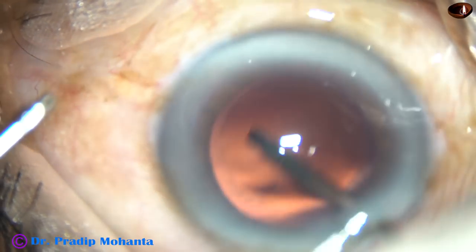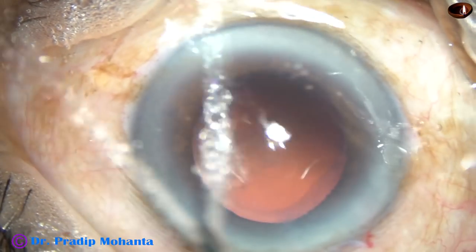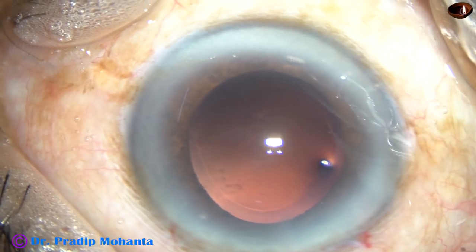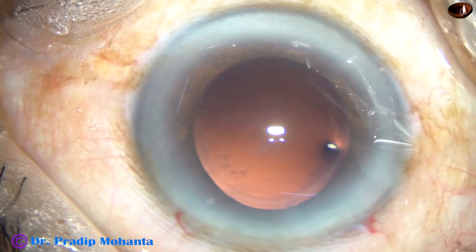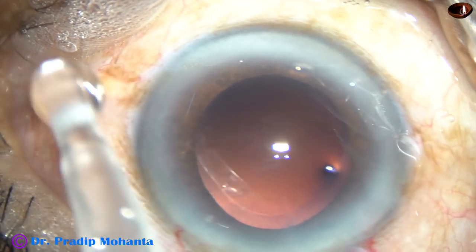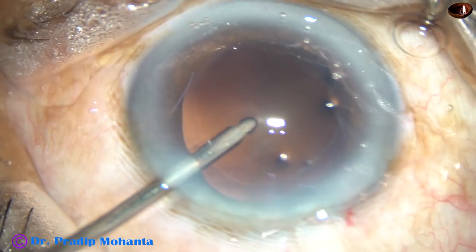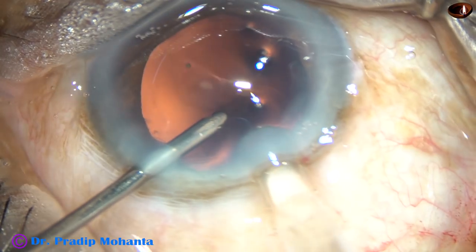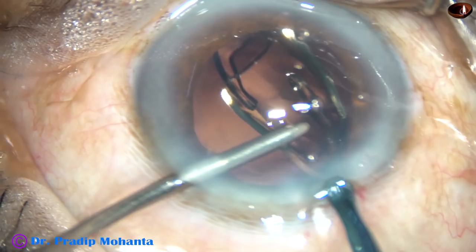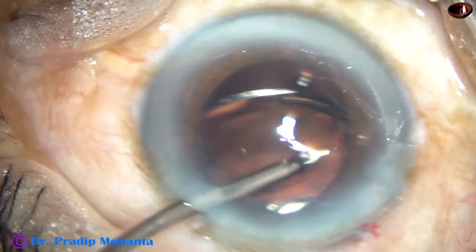Now this is hydropolish — the posterior capsule is being polished by the fluid jets of the irrigating probe. In this case we have selected a hydrophobic monofocal foldable intraocular lens. Here goes the lens into the capsular bag — the leading haptic goes in first, and the trailing haptic is pushed into the capsular bag by the left hand instrument.